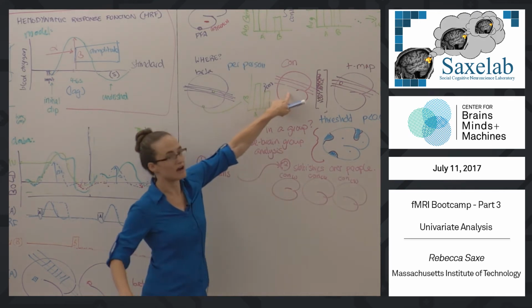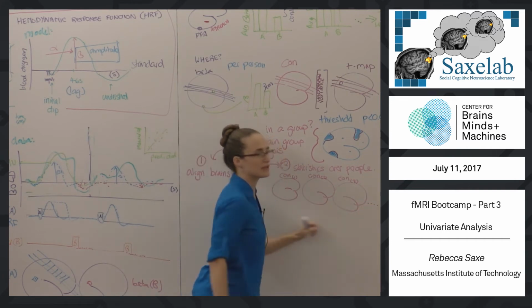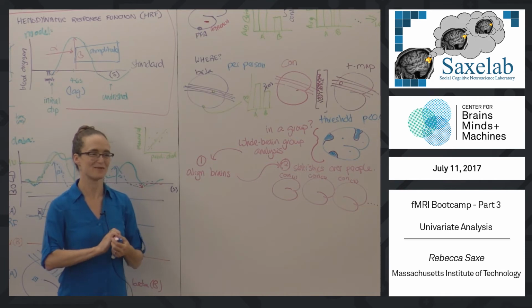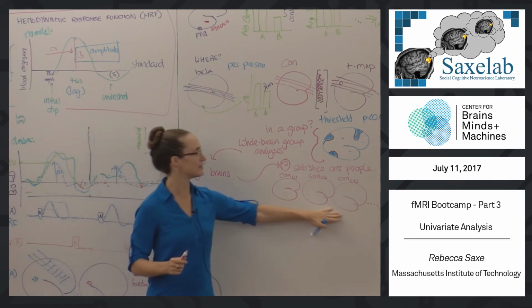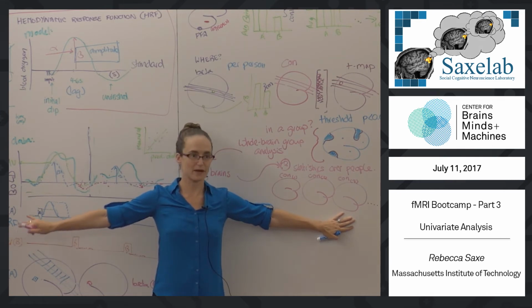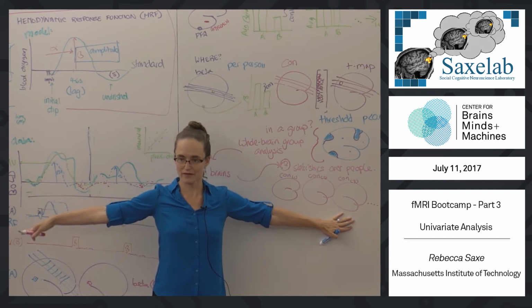OK. These are this contrast image, but for a set of people, 3 different people. A minimum of 8 people. It could be more than 8 people, but it's never less than 8 people. Right? So for each person, we did this whole procedure. We ran the experiment. They read verbs and nouns. We fit a beta for the verbs. We fit a beta for the nouns.